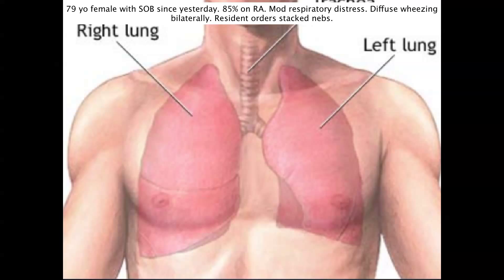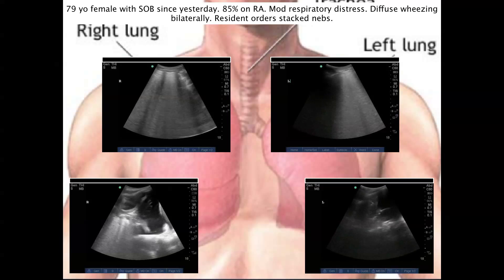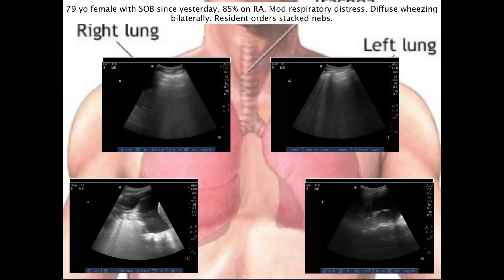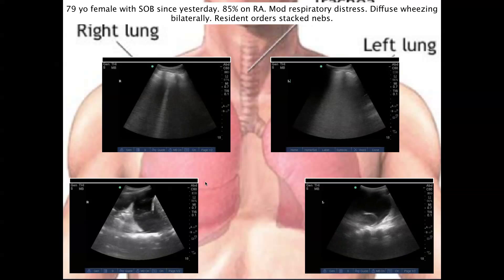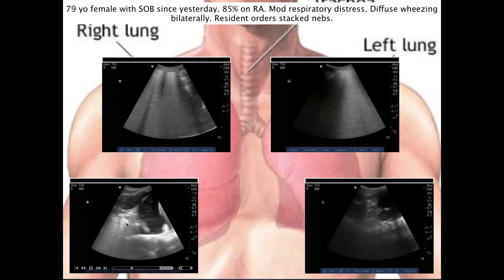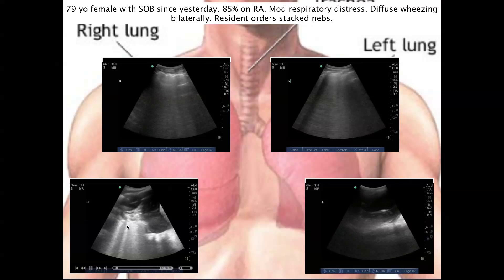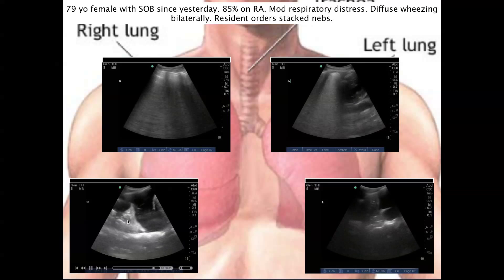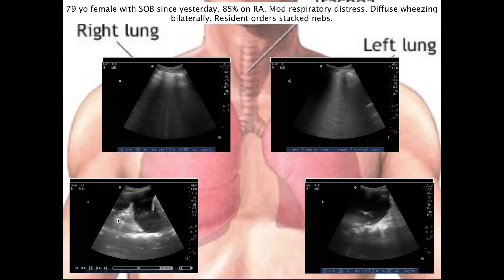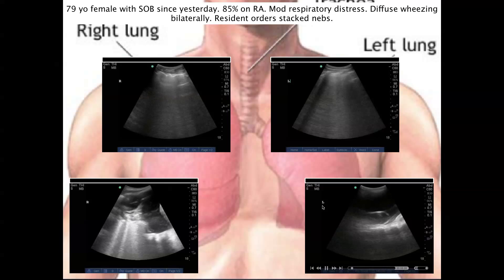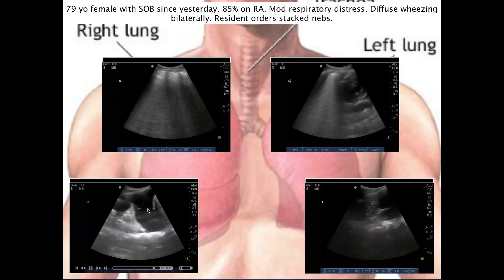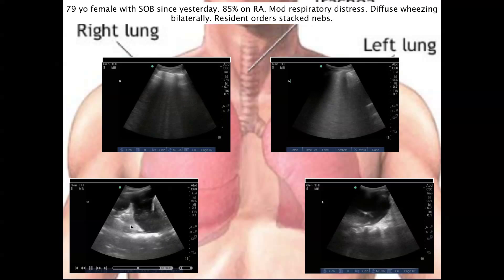A 79-year-old female came in with acute moderate respiratory distress and wheezing all over. Someone ordered nebs, then they did an ultrasound and quickly realized that the nebs aren't probably going to help. The patient has florid B-lines on both the right and the left, as well as large pleural effusions. You can see some consolidation of this lung, and these B-lines coming from the pneumonia or air bronchograms. This makes me think the patient has ARDS, paraneumonic effusions, or fluid overload with a concomitant pneumonia. This patient needs positive pressure ventilation, probably some diuresis, nitroglycerin, and maybe some antibiotics depending on the overall clinical picture.